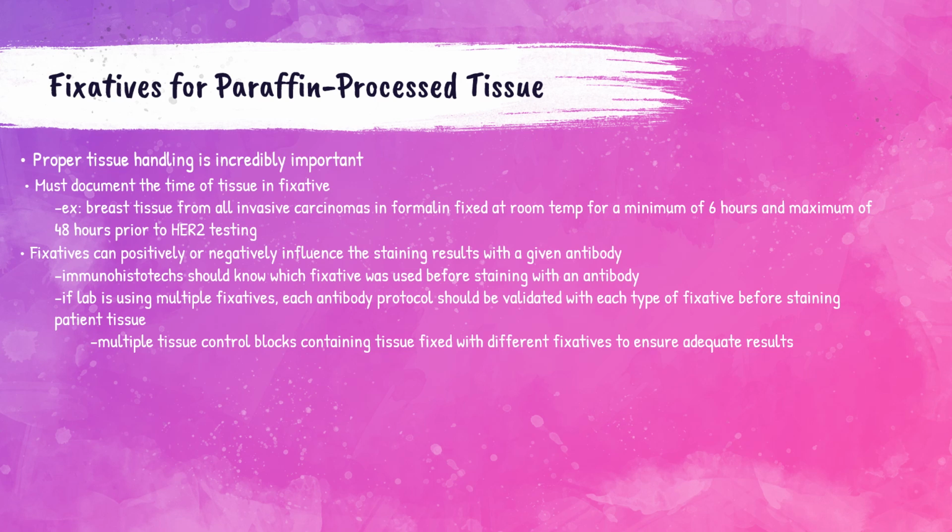If a laboratory is using multiple different types of fixatives, each antibody protocol should be validated with each of those types of fixatives to ensure that it works properly with them.